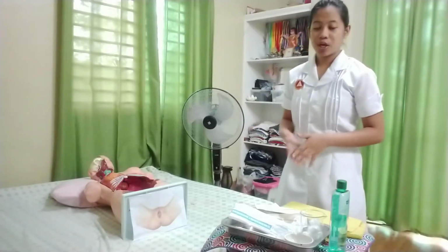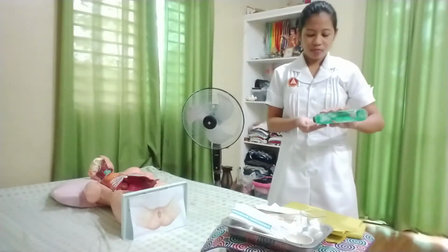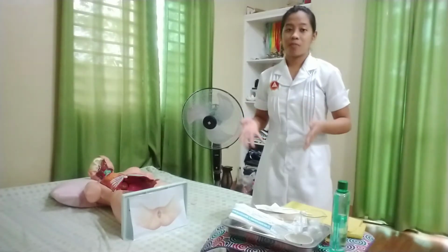So for the procedure, I will first assemble my equipment and perform hand washing and hand hygiene. After that, I will introduce myself to the client and verify the client's identity. This is to establish rapport and to verify that I am giving the proper care to the proper person. I will also explain the procedure, why it is necessary, and how the client can cooperate, and I will discuss any allergies with the client, especially iodine and latex.